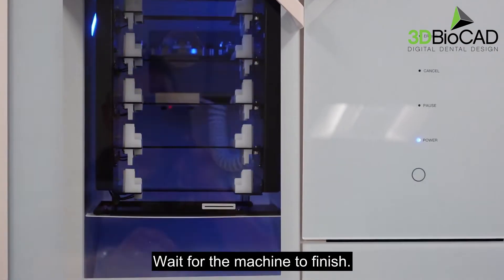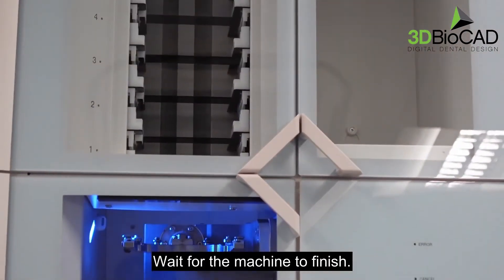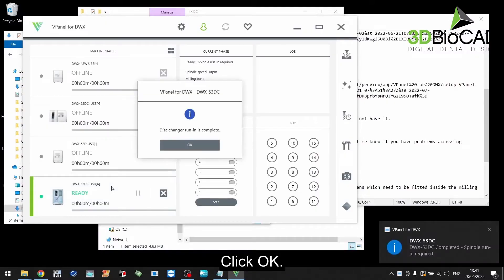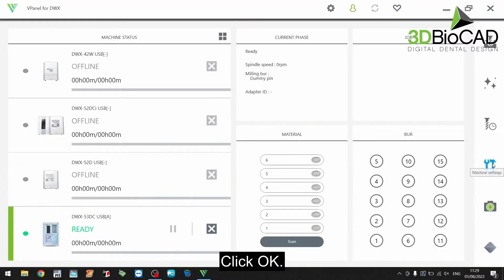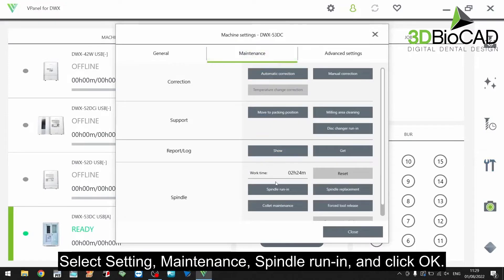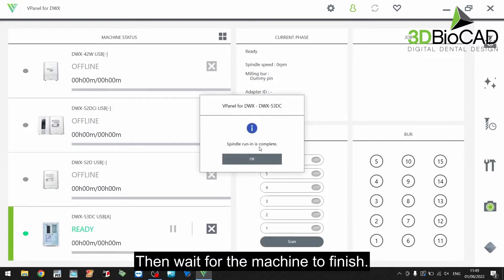Wait for the machine to finish, then click OK. Click settings, maintenance, spindle run-in. Click OK, then wait for the machine to finish. Then click OK.